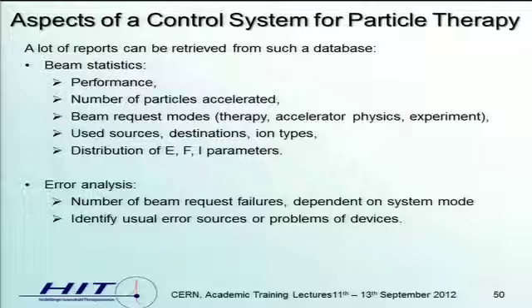A lot of reports can then be derived afterwards in case of failures. We can do error analysis days afterwards because we store these data for a long time. But we can also do a lot of beam statistics, on performance and on how and where the beam requests are, and so on and so on. So this is a worthwhile thing to see.